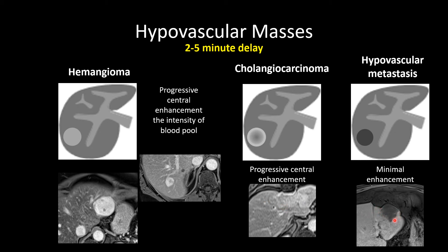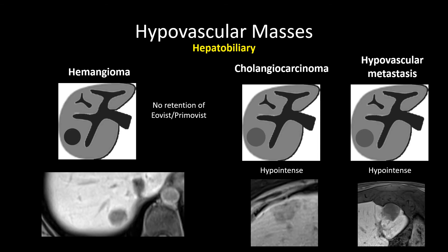In this delay, we see minimal peripheral enhancement of this GI primary adenocarcinoma metastasis. The enhancement pattern of a metastatic adenocarcinoma will be variable — this is a very hypovascular metastasis but could look very similar, if not identical, to the cholangiocarcinoma. In the hepatobiliary phase, we should see hypointensity uniformly across almost all hypovascular masses, whether benign or malignant.